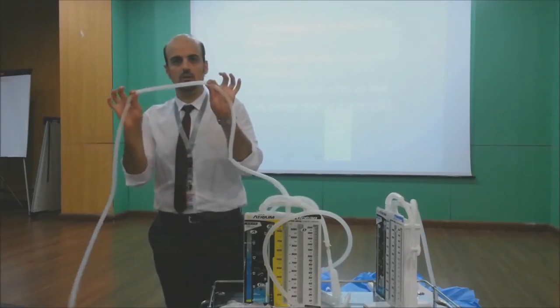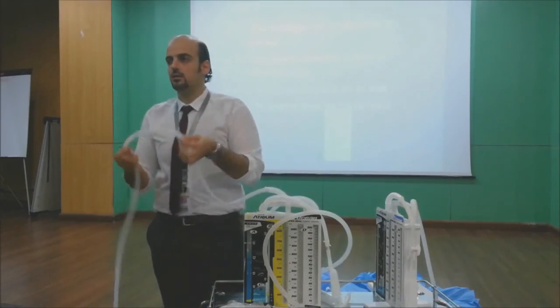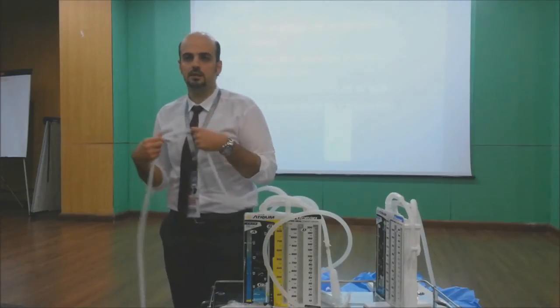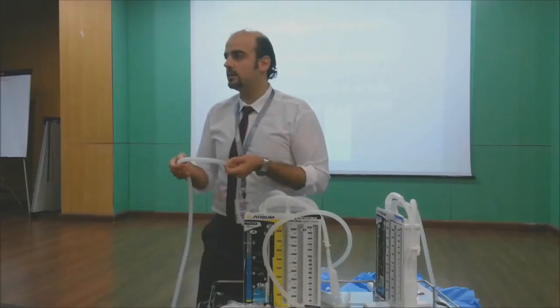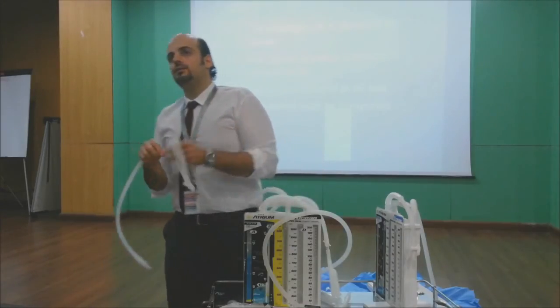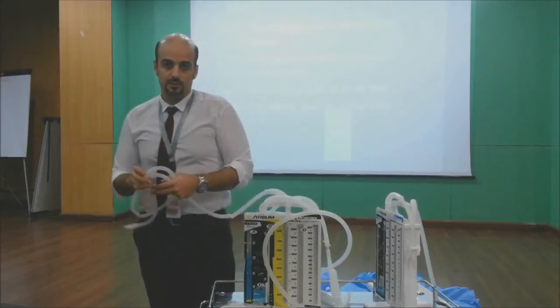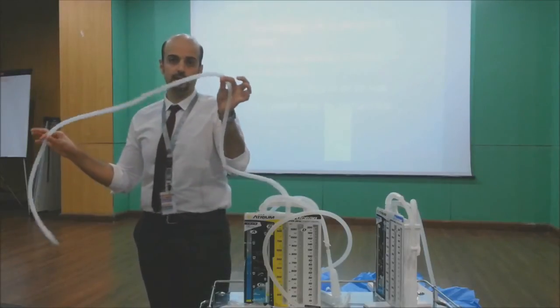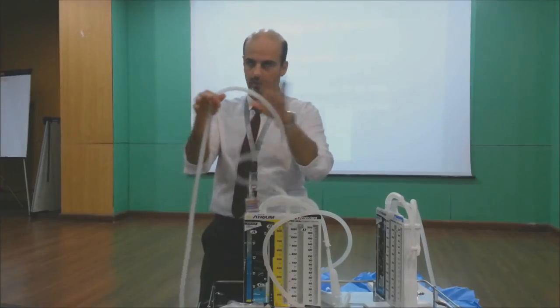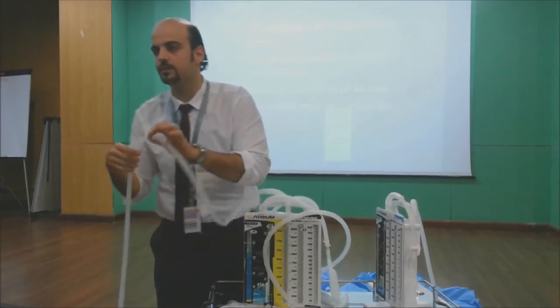The capacity is only 5 liters, so the rest, 2 liters, will stay in the chest, and the lung will collapse. So we apply negative suction. Negative suction helps us increase this capability to 10. These are examples, not accurate numbers.